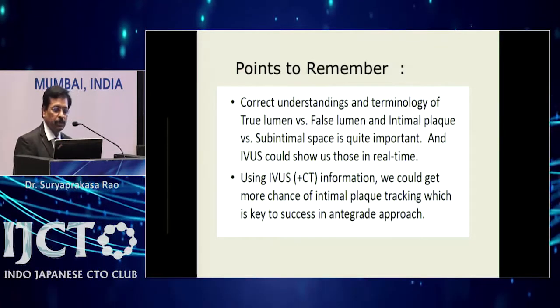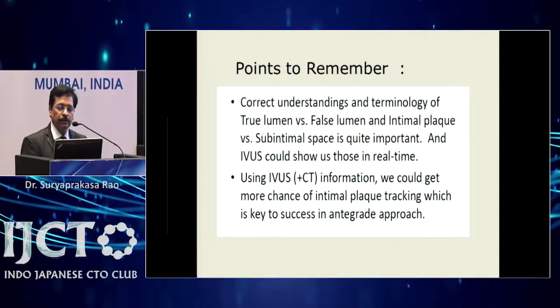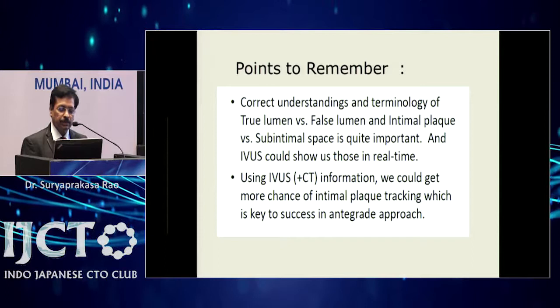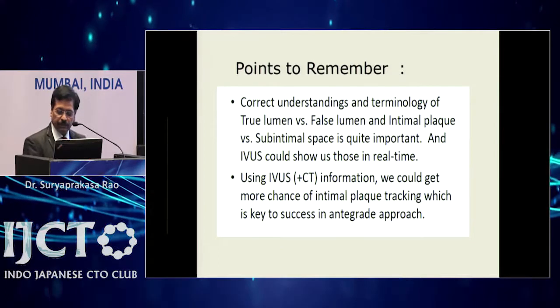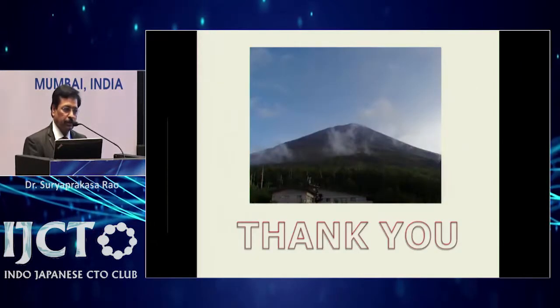So the points we have to remember: the correct understanding of the true lumen, false lumen, intimal plaque, and subintimal space is very important. And if you have CT information along with IVUS, it is more useful. Thank you.